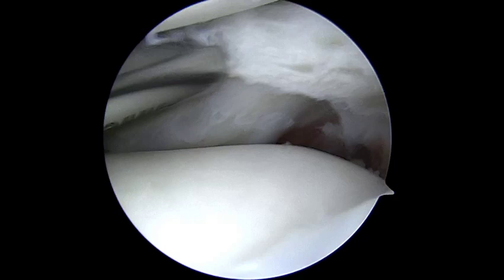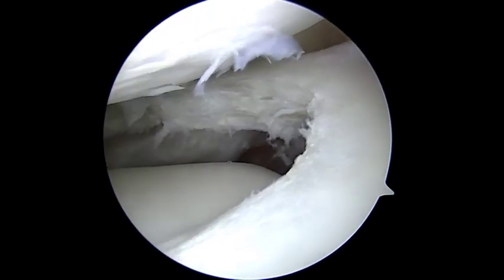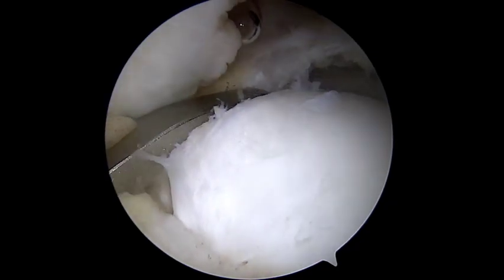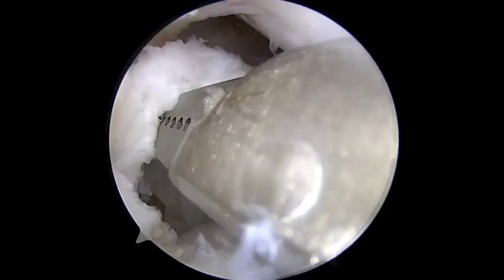A combination of an arthroscopic biter and shaver are used to debride the meniscal tear back to healthy tissue and a stable rim. A meniscal root repair guide is utilized to drill a tunnel with a cannulated guide pin from distal medial to proximal lateral at the footprint of the lateral meniscus posterior root.